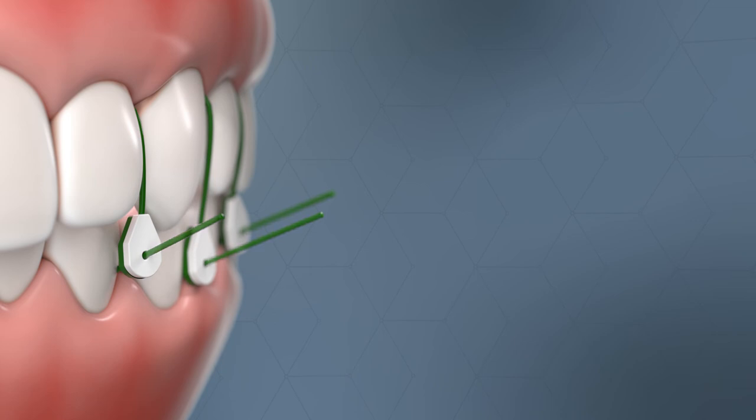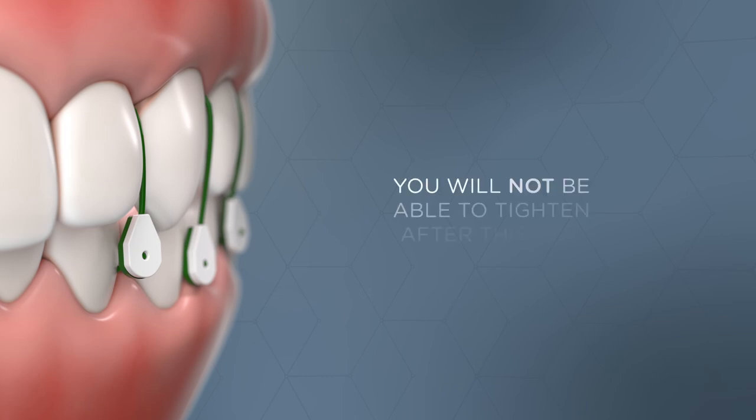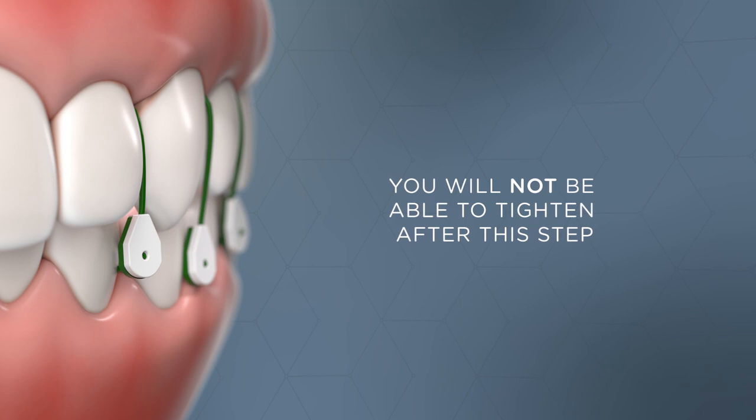Or for closed treatment, cut the suture with a scalpel as close to the clasp head as possible so it is flush and smooth, maximizing patient comfort. You will not be able to tighten after this step.